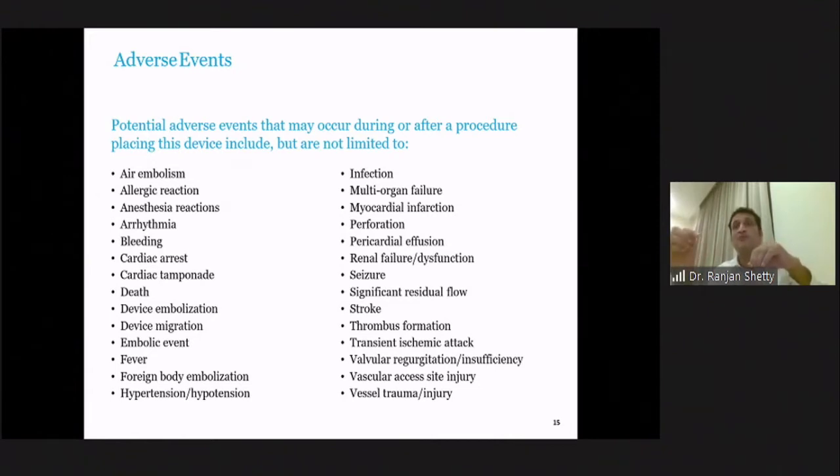I sometimes use an Amplatzer Super Stiff wire inside the pigtail, not allowing it to come out, to give me that extra position to take the sheath inside, anti-clockwise as much as possible. Pull the pigtail back and then introduce your sheath. Make sure there is no air in the system anywhere, and look for this.